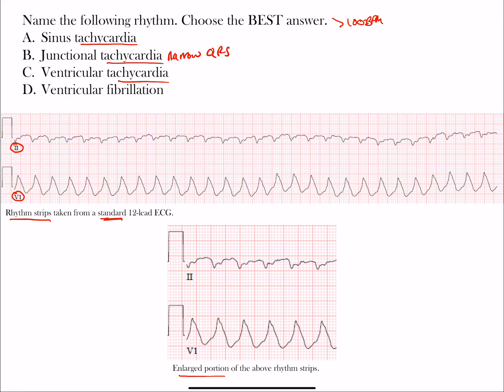This is a regular rhythm. We always have P waves in these leads, a regular rhythm as well. We know that the rates are all over 100, so we can add that to part of the criteria for each. And then ventricular tachycardia - this is wide QRS, a regular rhythm again, a rate over 100 beats per minute.